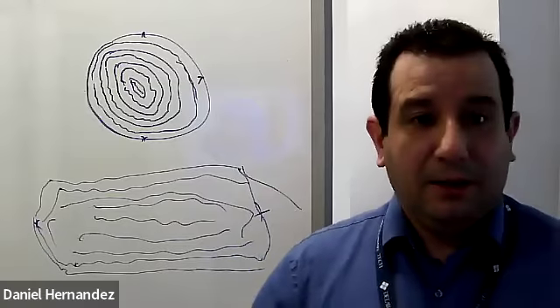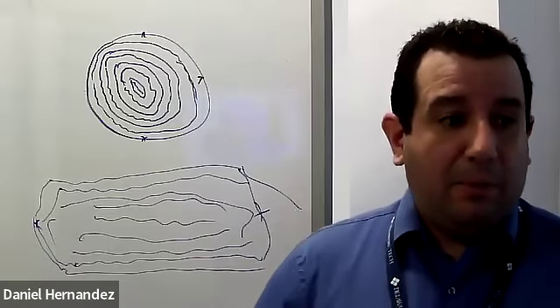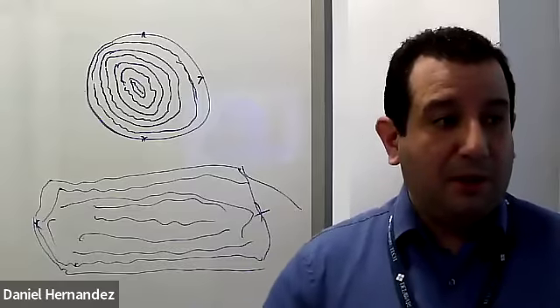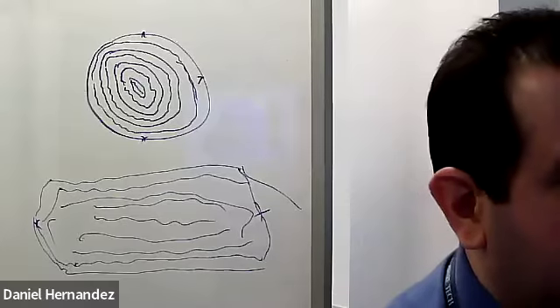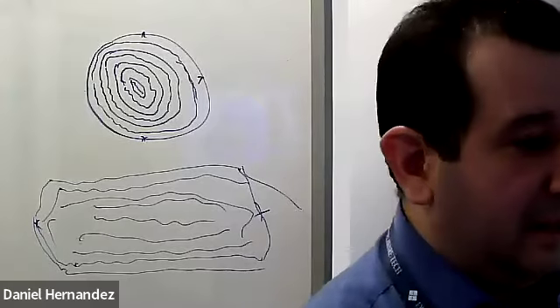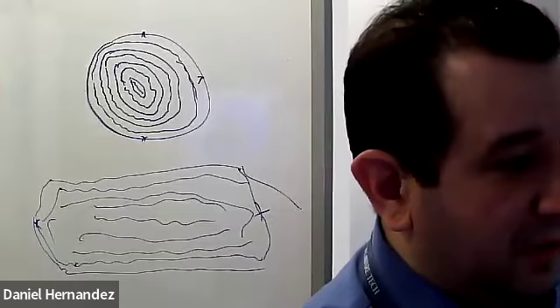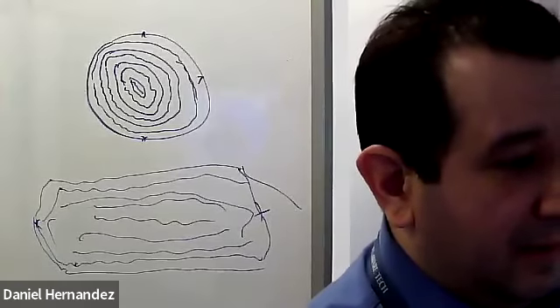If it's successful, they'll come back to you after the IR procedure to rescan them. And when you're rescanning them, you could see inflammation in that area of the ileocecal junction. So that ileocecal valve might still be inflamed afterwards. This is kind of what it's showing. The ultrasound will help differentiate between just inflammation of the ileocecal valve versus there still being an intussusception present. So with this, we're just seeing some inflammation. We're not seeing those same concentric rings that we did with the actual target sign.